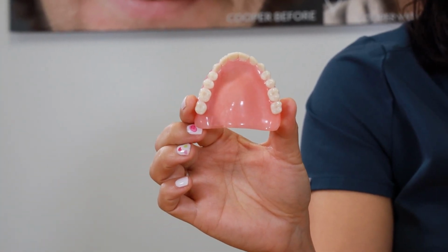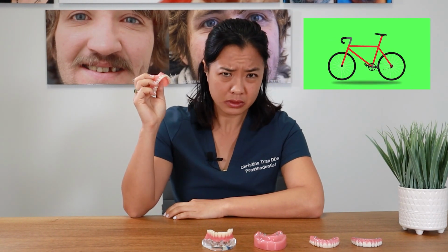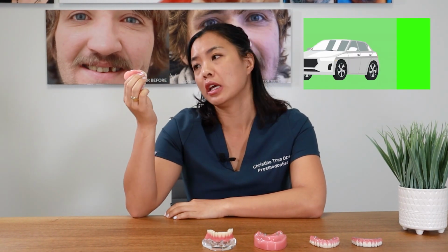And a lot of patients, when they undergo a smile transformation, they dream about eating steak. Who wouldn't, right? But with a denture, you really can't. You can't chew in the front. You can't bite into an apple or bite into a sandwich. So there are certain limitations to a denture. For all the prosthetics, I make the comparison of a different mode of transportation. I would say a denture is like a bicycle in comparison to a car or a plane. It'll get you there, but it's pretty basic and it requires a little more work from you.